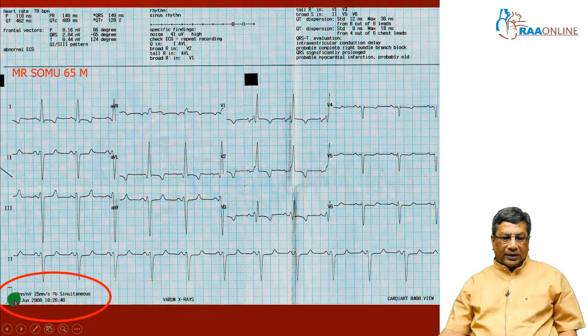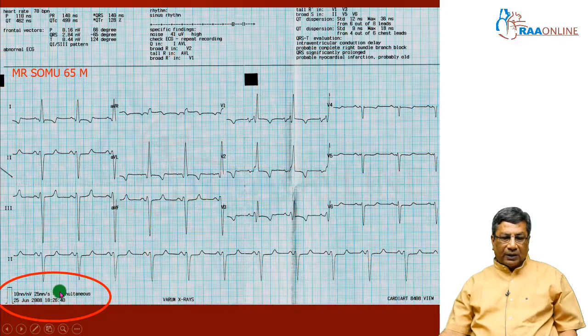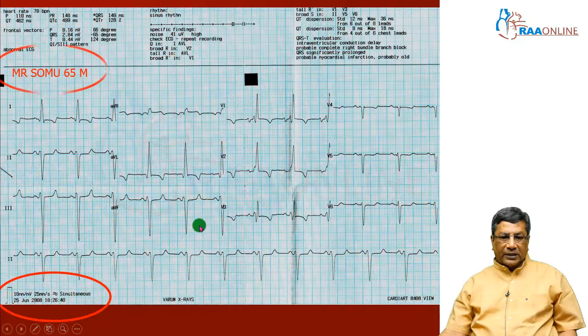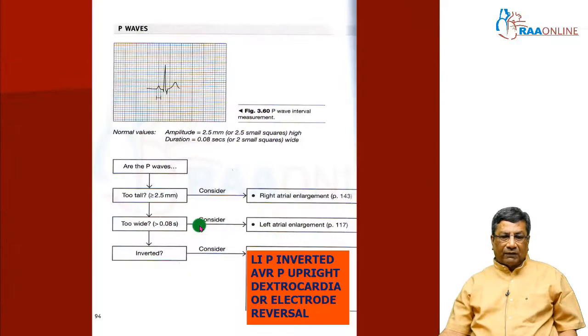Then look at the standardization: 10 millimeter standardization and a recording speed of 25 millimeters per second. Never interpret an electrocardiogram without these details.